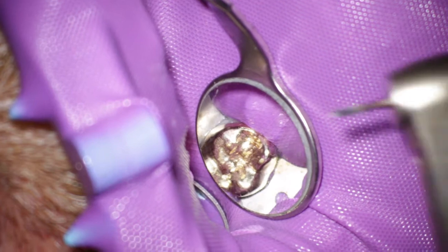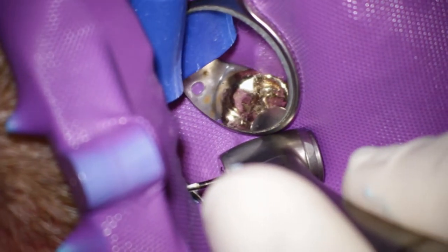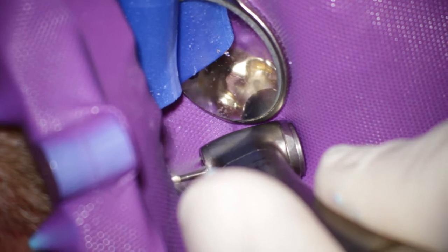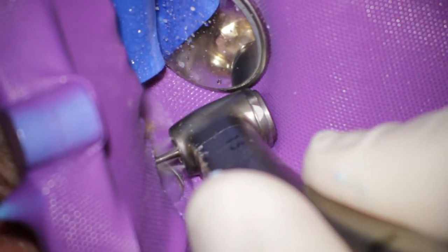One thing that is most important in dentistry is to have the right tools at the right time with the right purpose. So in this case, I knew that under that crown I will find a post that has to be removed. The patient was sent to me to retreat a formerly performed root canal filling because a new crown was planned.